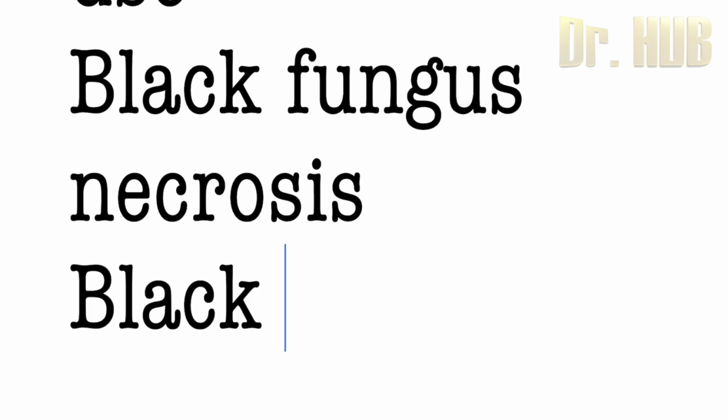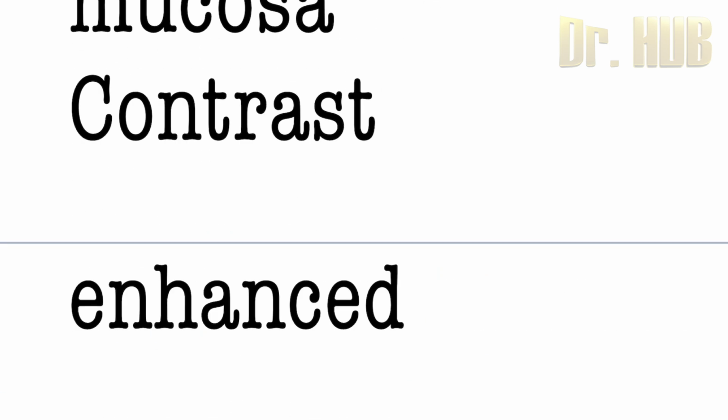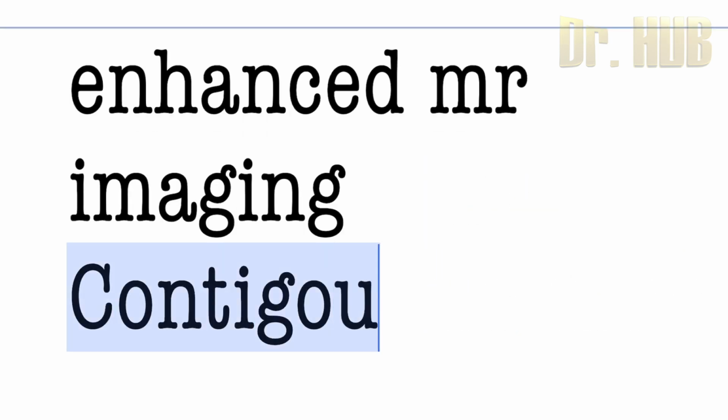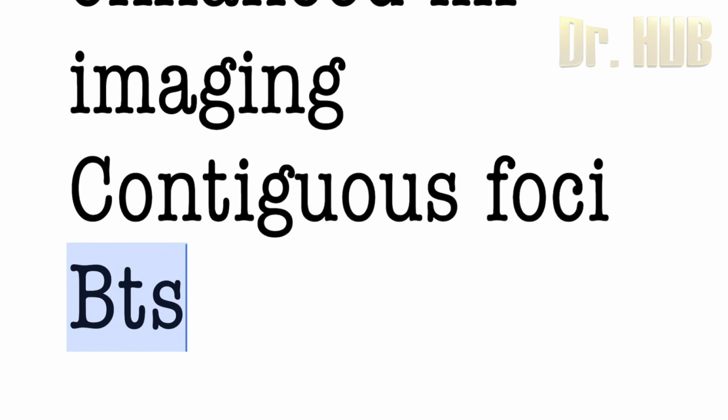There is also the presence of the black turbinate sign. The black turbinate sign is a devitalized mucosa, and it appears on contrast enhanced MR imaging as a contiguous focus of non-enhancing tissue, and it leads to the black turbinate sign, that is BTS.